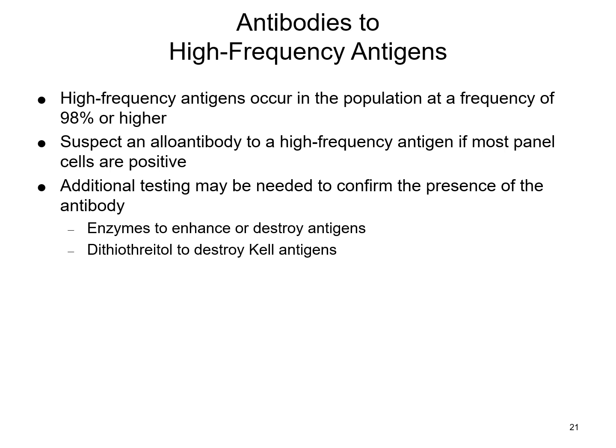Now, the likelihood of you doing this in a regular, everyday blood bank in most of your hospitals that do surgeries or have an emergency room, have OB patients, things like that, is low. You're not going to do a lot of this enzymatic testing and treatments. This is usually going to be at your blood centers, like your Red Cross or some of the blood centers within your area, whether it's a blood center that's associated with the hospital or whatnot.